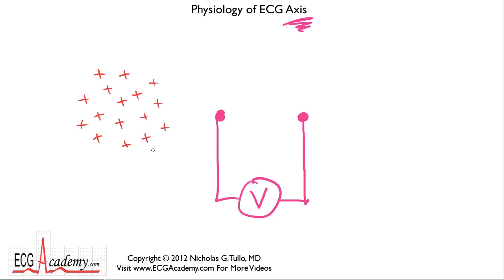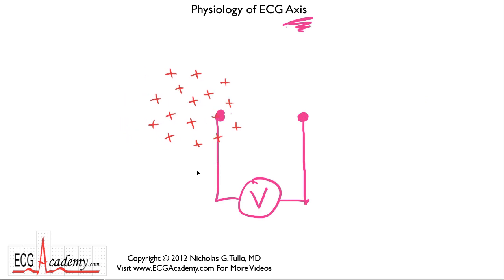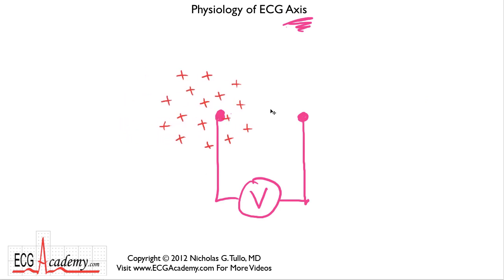In the body, of course, the cardiac cells depolarize through their action potential. The cells become more positive on the inside, and this movement of sodium and potassium ions creates this electrical signal. So as the electrical signal moves towards this recording bipole, or basically 2 poles of an electrical recording system, they'll encounter the first electrode, and so now there's a difference in electrical potential between the two. So the machine records a positive deflection.